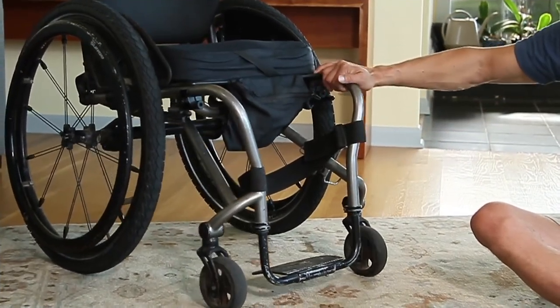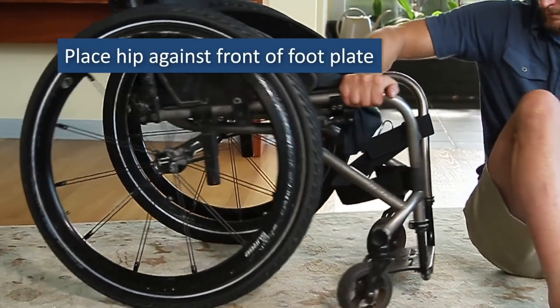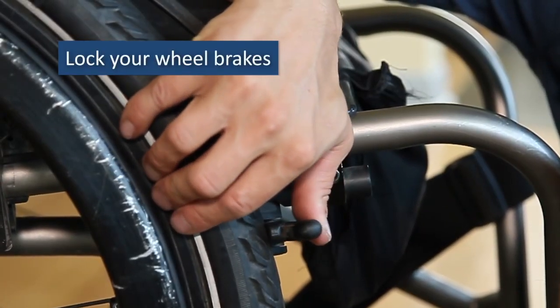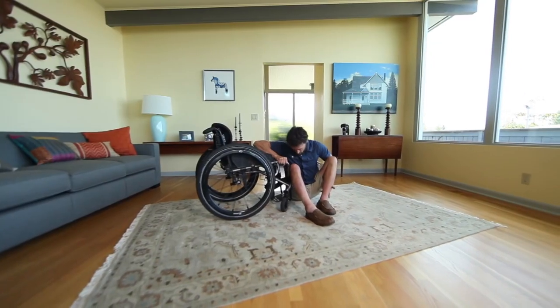To get back into your wheelchair, pull it to your side so that your hip is against the front of your foot plate. Lock your brakes. Grasp the front of your wheelchair frame with your leading hand, placing your elbow on your chair seat.